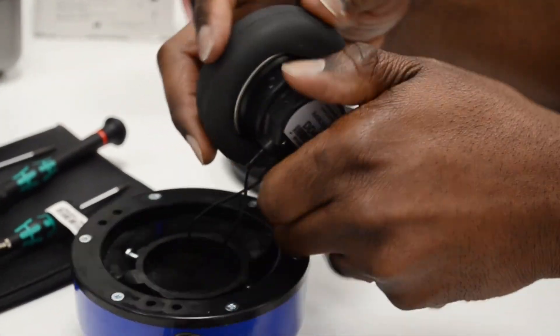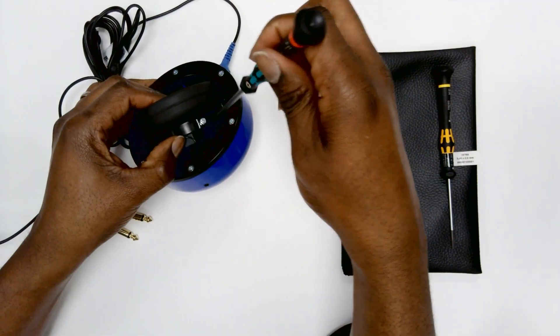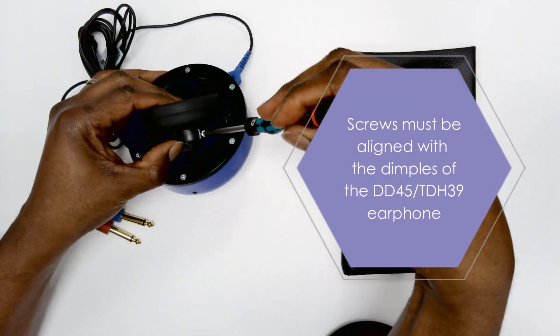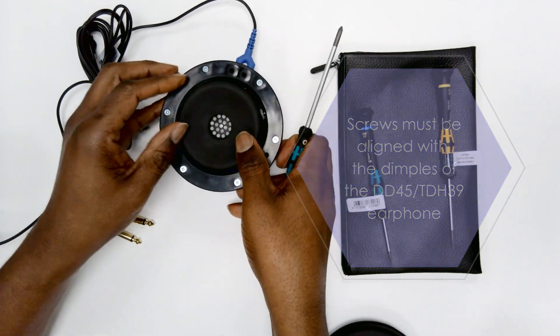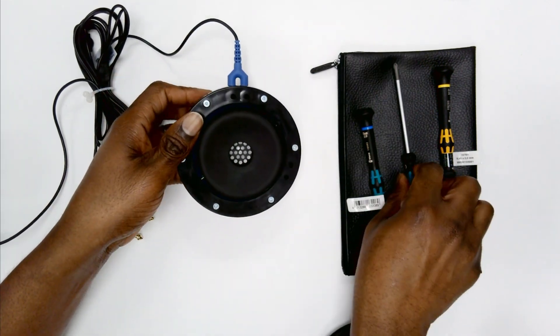Reattach the ear cushion you removed at the start to the earphone. Now you can fix the earphone to the support ring. There are several holes on this ring but it's advised you do this using the two diagonal holes opposite the audio cup ear shell connector. Ensure these are aligned with the holes in the earphone and screw them in to fix them together. Do not over tighten the screws.